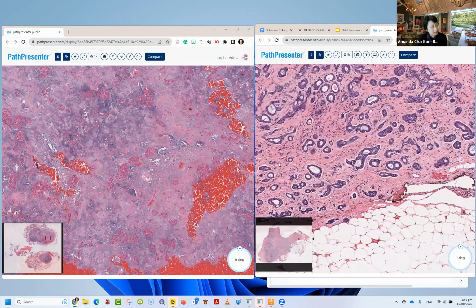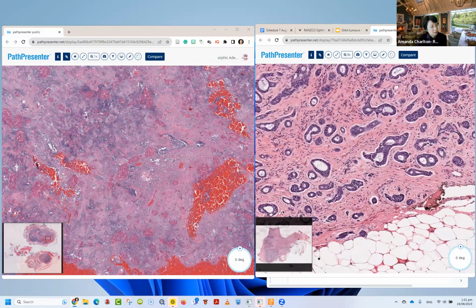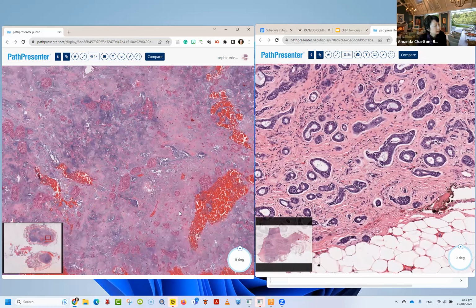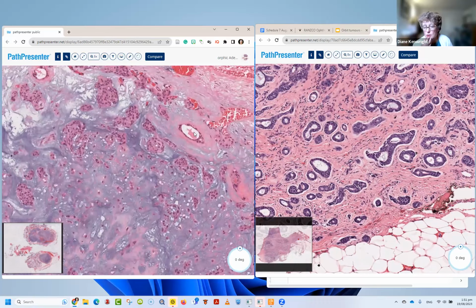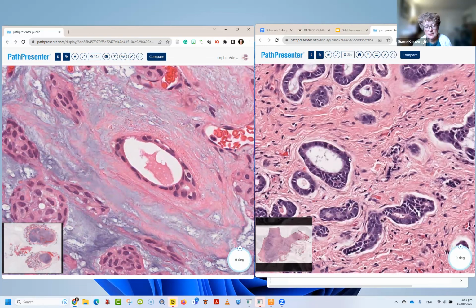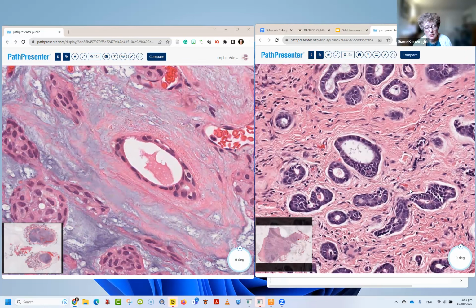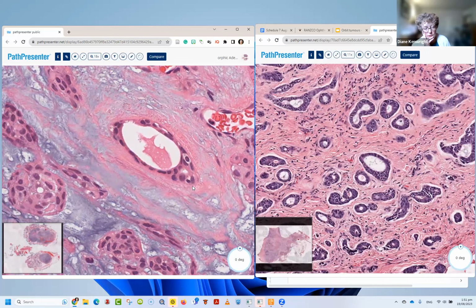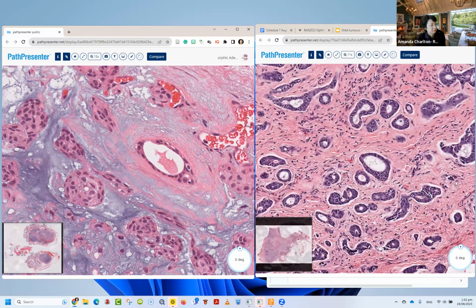So how is that different over here in the pleomorphic adenoma? We have this extracellular blue stuff, and here we have blue mucin-like material within the duct lumen. It's a bit confusing. So the epithelial cells produce mucus, which has got lots of polysaccharides in and looks blue. And myoepithelial cells produce lots of myxoid stroma, which has got polysaccharides in and looks blue. So the color just tells us what it's made of, not where it's come from. Yeah. So we can see there are similarities and differences.